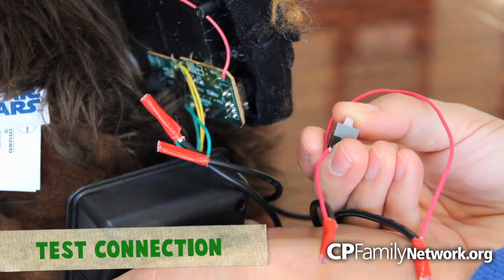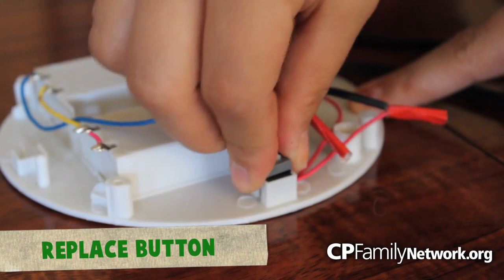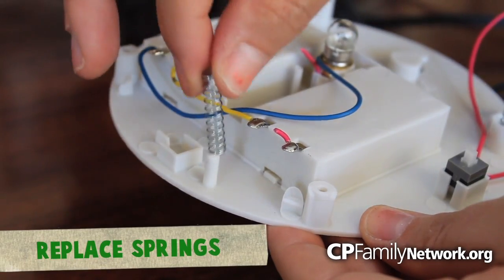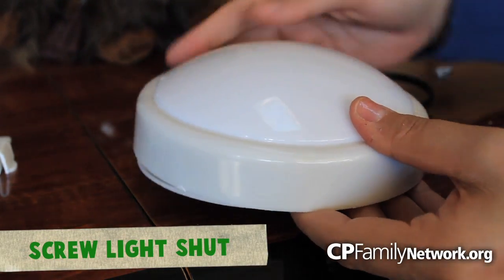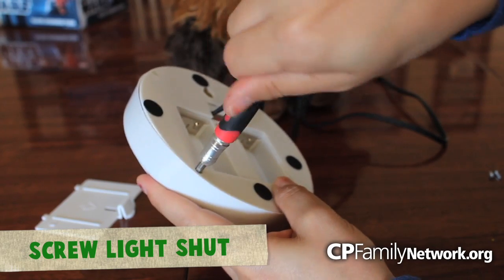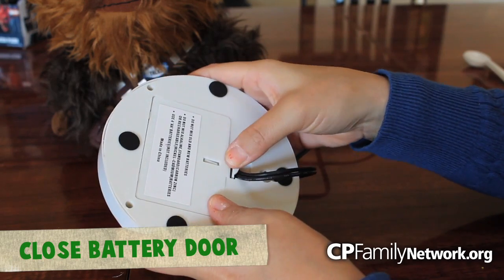Now, you can go ahead and test the clicker button to make sure that it's working. Place the clicker back in its place. Make sure you get all the screws and springs correctly in place and put the lid back on the push light. Screw it back closed.